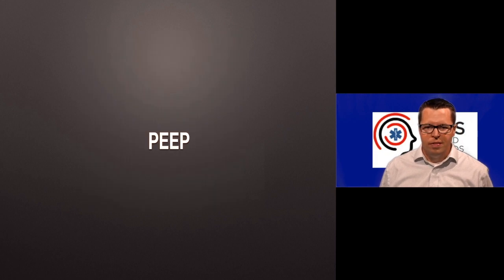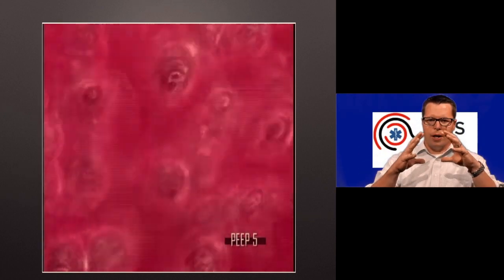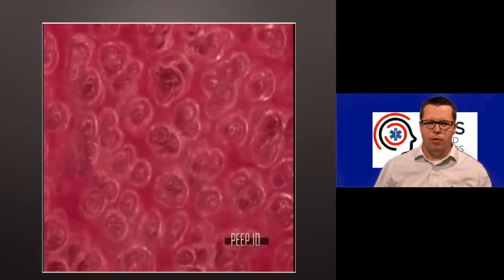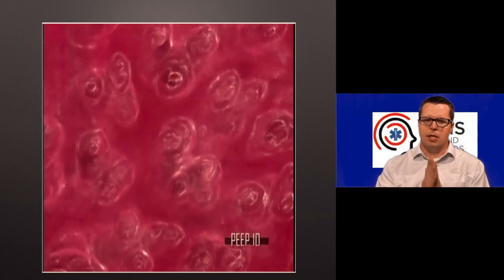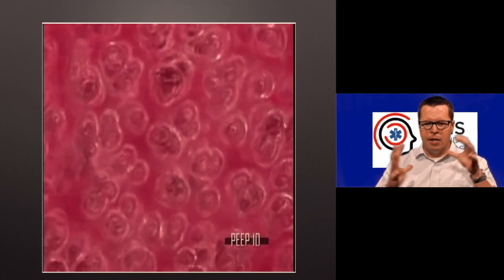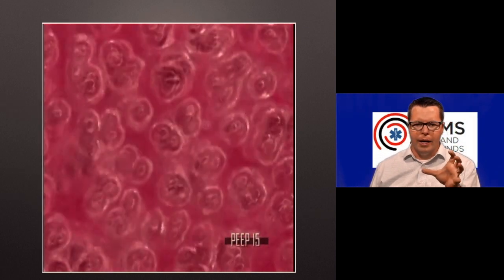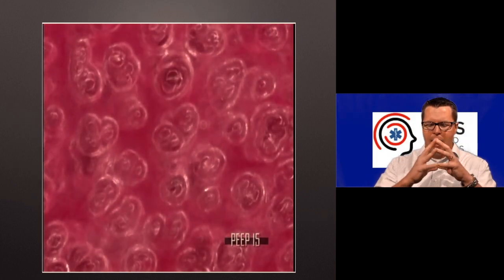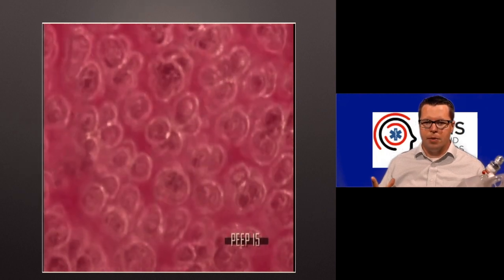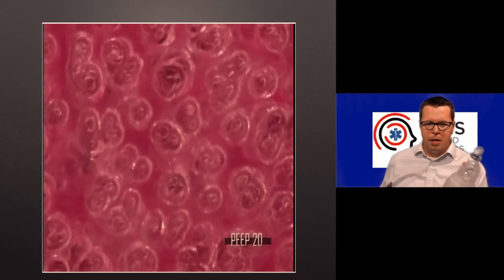Not actually the case. Talking about PEEP itself first, what is PEEP? Again, positive end expiratory pressure. Basically, after a breath, your lungs get a little bit of pressure still stuck in them when you are using PEEP. If you don't use PEEP, then your lungs will recollapse each time. And you see the alveoli here will progressively open up more and more as they increase the PEEP. This is a PEEP of 10. He's going to get to 15 in a second. You'll see even more alveoli continue to stay open after each breath. And what does that do? That allows you to keep more lung segments open, not overpressurize things, and you get much better oxygenation by better use of your lungs. So PEEP is important.